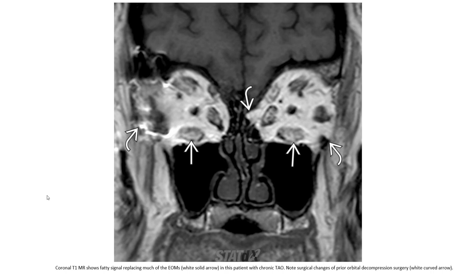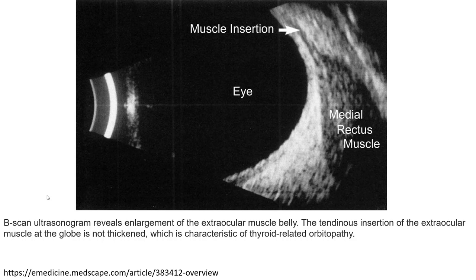This MRI image shows fatty signal replacing the mass of extraocular muscle in a patient with chronic thyroid-associated ocular disease. Note the changes of prior orbital decompression surgery. B-scan ultrasound reveals enlargement of the extraocular muscle belly, while the tendon insertion of the extraocular muscle is not thickened.